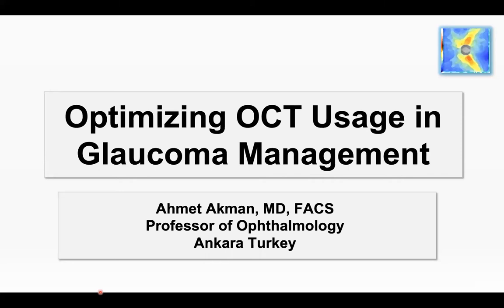Now let's start. This webinar is about optimizing OCT usage in glaucoma management. So instead of going into details of the literature data, I will try to concentrate on the practical aspects and practical usage of OCT in glaucoma management with interesting case examples.